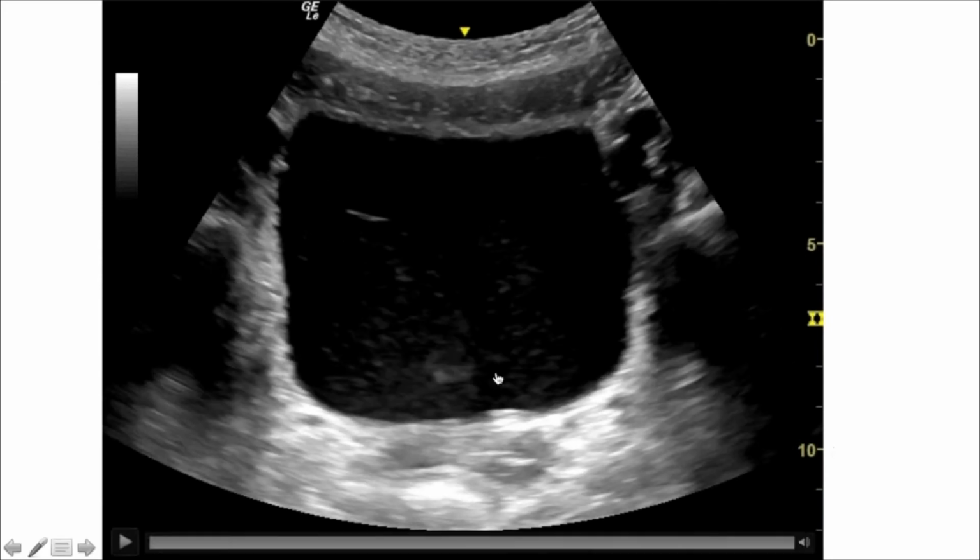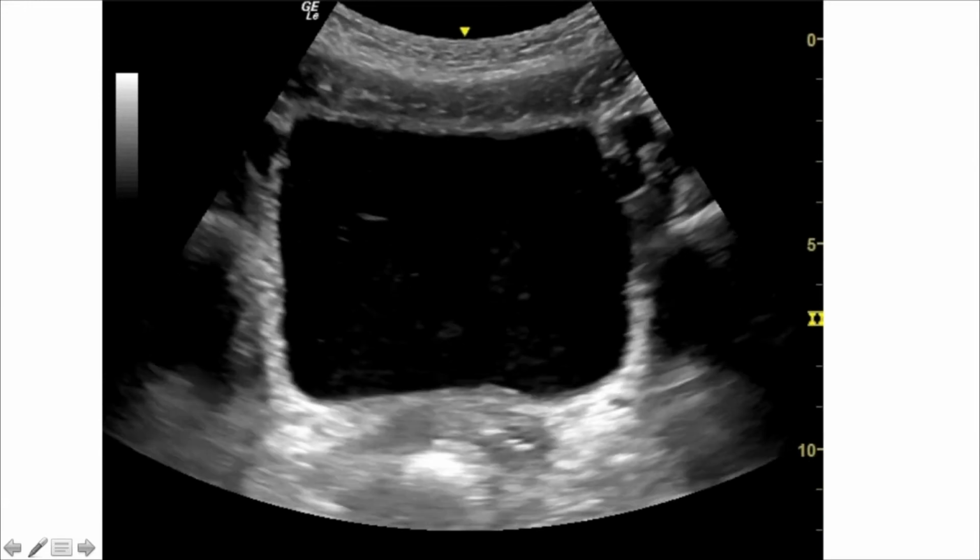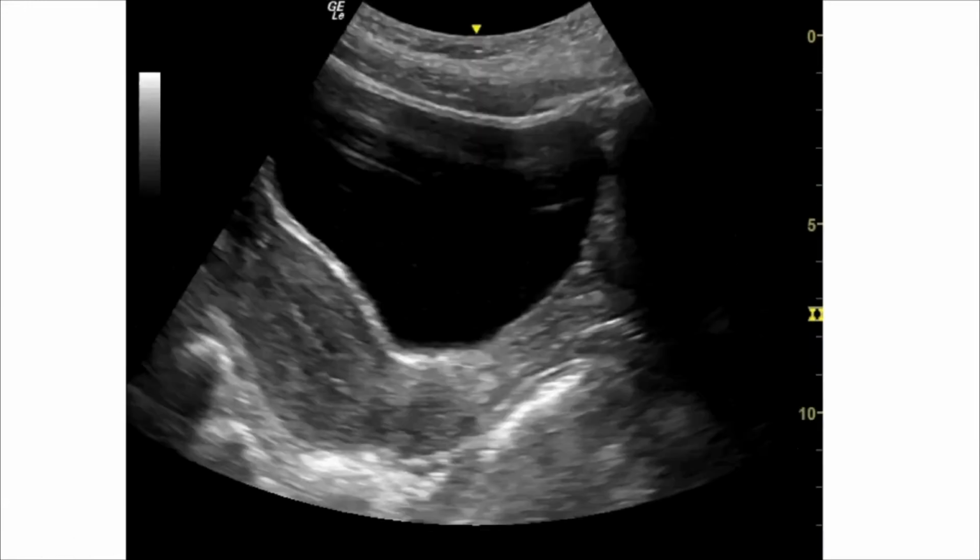And some also might notice as you're looking at the bladder contents, you can actually see some of the fluid moving. Again, if you remember what you're looking through with a transducer, it's sound waves that are penetrating the tissue, so they can create some bubbling in that fluid and micromotion, so you can actually see the fluid move based on that sound wave.